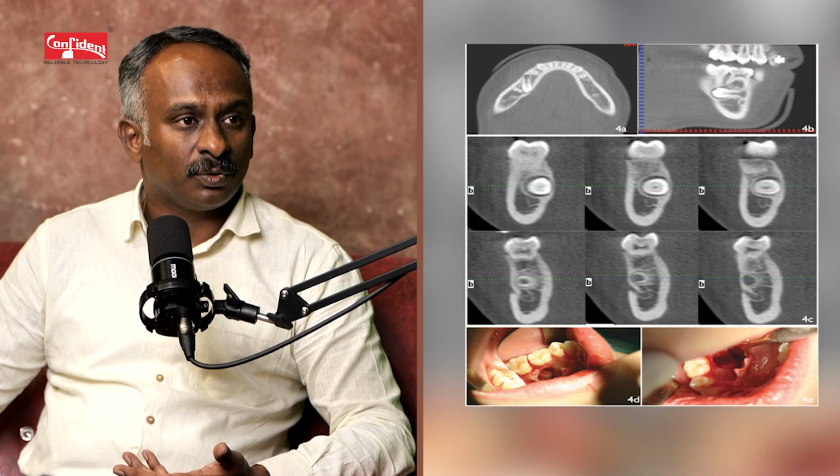Pediatric tumors have been increasing of late, and identification has also increased because the parents are very worried about their kids. In those situations, cysts and tumors can also be assessed, which helps us in assessing the size, the volume, and the shape of it.